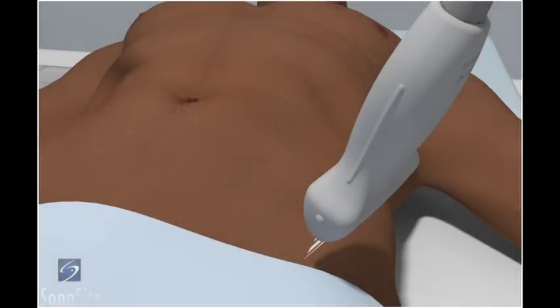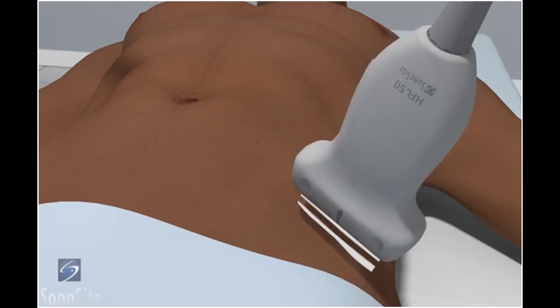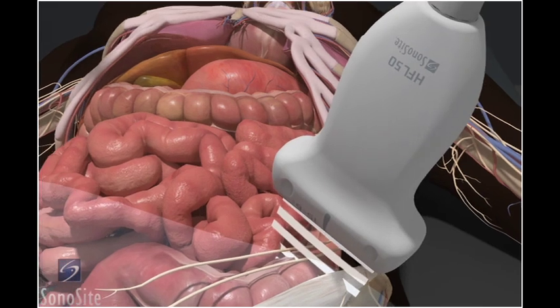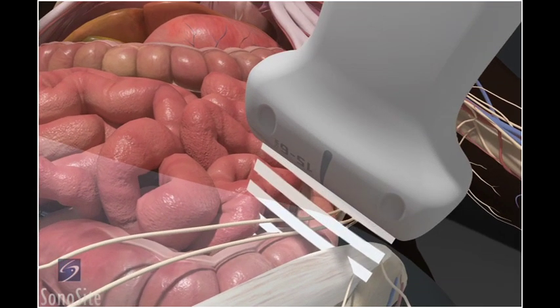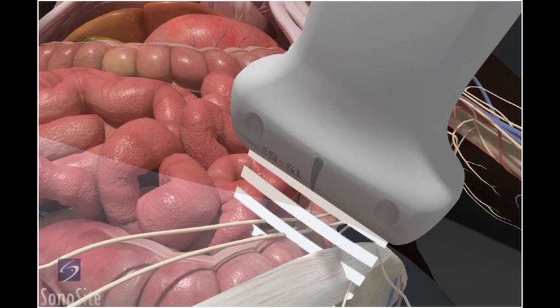The patient is positioned supine. The transducer is placed over the bony prominence of the anterior superior iliac spine with the orientation marker directed to the patient's right. The transducer is then rotated slightly counterclockwise, so one side rests on the anterior superior iliac spine and the other side points at the umbilicus.